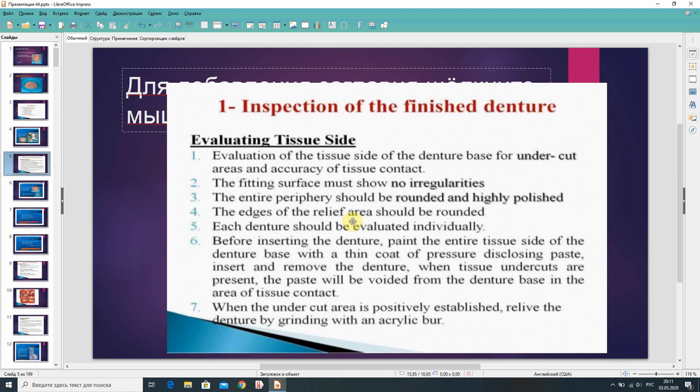The entire periphery should be rounded and highly polished, and the edge of the relief area should be rounded. Each denture should be evaluated individually. Before inserting the denture, paint the entire teeth side of the denture base with a thin coat of pressure disclosing paste. Insert and remove the denture; when teeth undercuts are present, the paste will be displaced from the denture base in the area of teeth contact. When the undercut area is positively established, relieve the denture base by grinding with an acrylic burr.